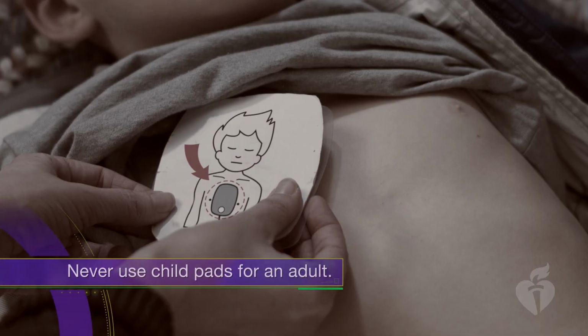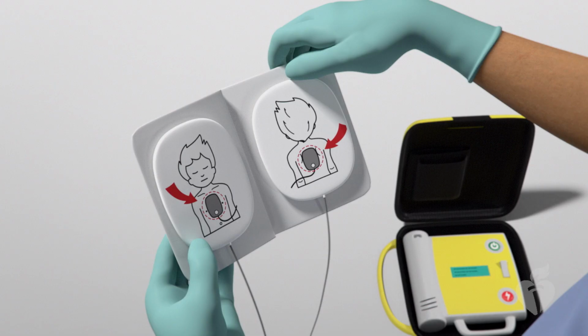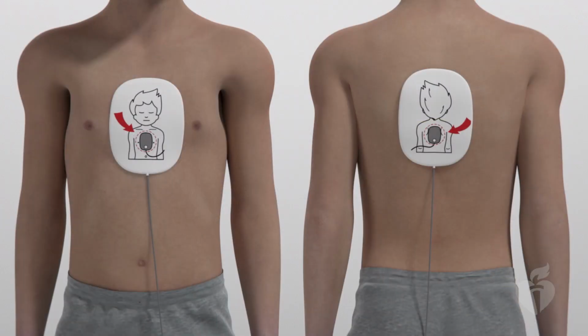However, you should never use the child pads for an adult. The shock dose delivered by child pads is too small for an adult, and it will likely not be successful. It's better to provide high-quality CPR than to attempt to shock an adult victim with child pads. Some AED pads recommend a different pad placement for infants and children, placing one pad on the chest and one on the back. Follow the pictures on the pad packages for proper pad placement.